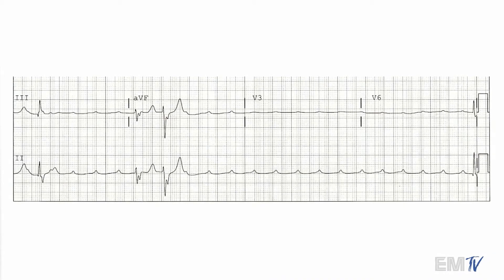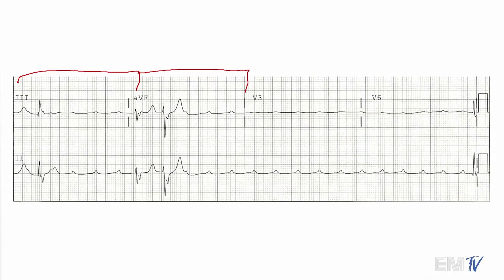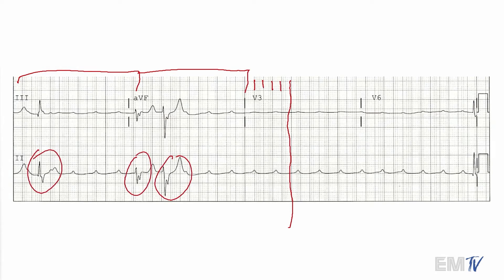The method I use for cutting this into a 6 second strip to make the math easy when I'm calculating rate is I'll take 2 of the sections which are equal to 2.5 seconds each and then I'll add 5 large boxes to make our 6 second strip. With my 6 second strip I'll go ahead and count my QRS complexes. I'm seeing 3, so I would say that this is 30 BPM.